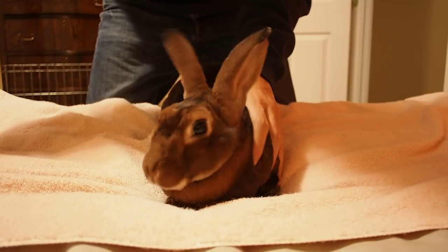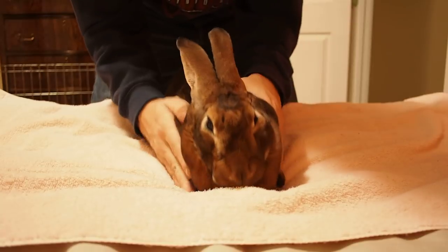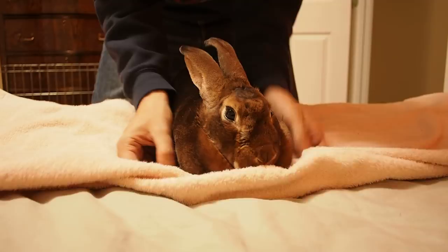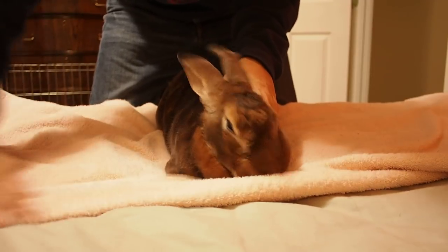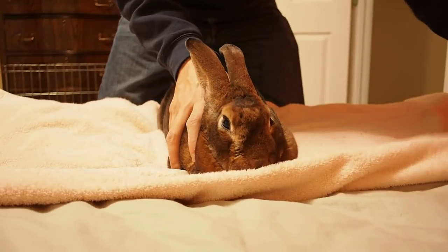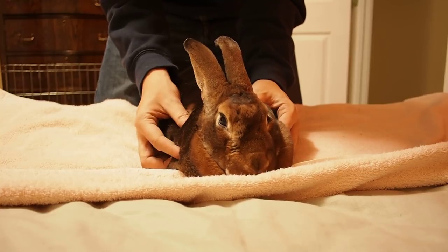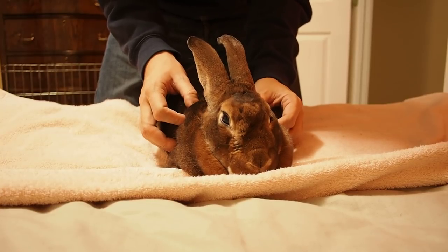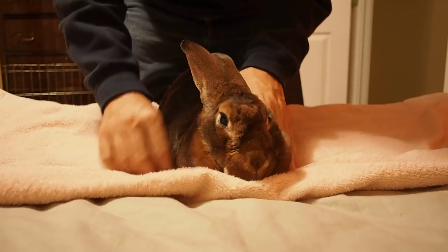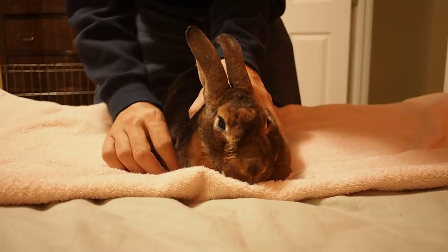I like to wrap over — oh, she knows what this is. Want to make sure they're nice and flat. You want to fold over the bunrito, the first fold here, all the way out to restrain the front paws. This is so important. Notice how I have pressure on the scapular halves here, on the cervical scapular spine. Tuck it in just like that. Don't put pressure directly on the spine, but put pressure on the scapular halves a little bit.